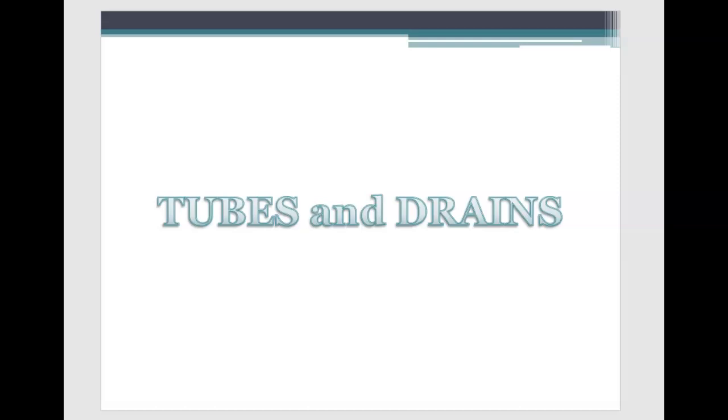Let's talk a little bit about some tubes and drains. So in your chapter reading, we're going to just highlight some of these tubes and drains. I passed around an NG tube in class. We can put NG tubes to suction, drainage. We have something called a Salem sump. We have wound drainages. We have Hemovacs. We have Jackson Pratts. So we need to identify options for toileting and devices to be used.